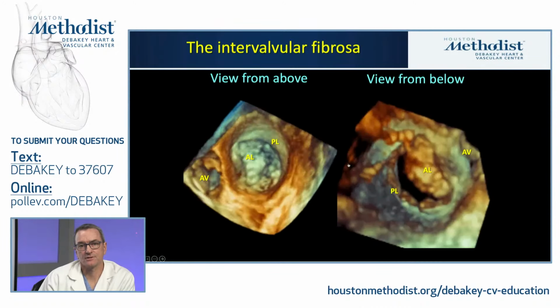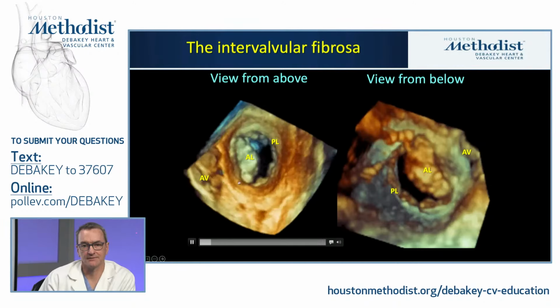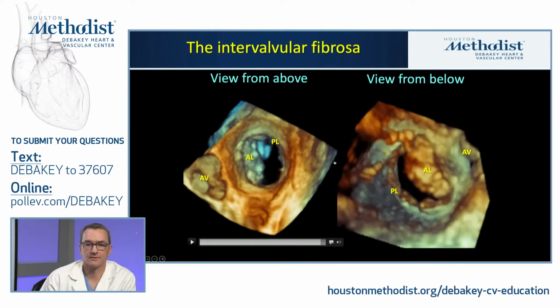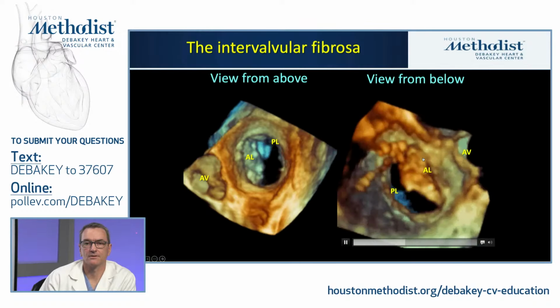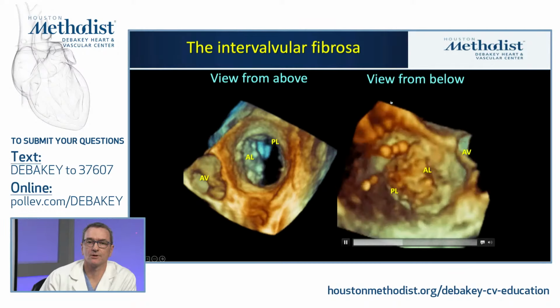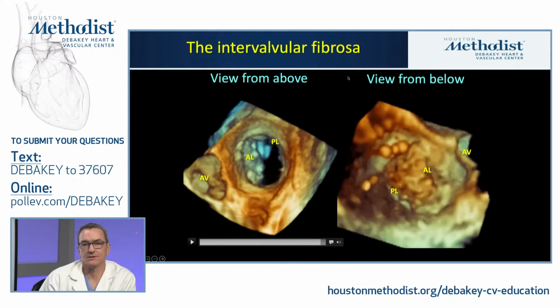If you look at the function of the intervalvular fibrosa, so this is a 3D view looking at the mitral valve, the anterior leaflet shown here, aortic valve to the left. If you look at this sort of pulsatile region here, you can see that the aortic outflow actually pulses through the anterior mitral leaflet and helps provide some closure. That's from above and from below. Again, looking up the LVOT. All of this just to emphasize, this is a very normal heart, probably the only normal I'll show you on this talk, but all of this anatomy is very close together.